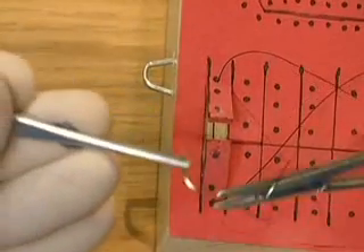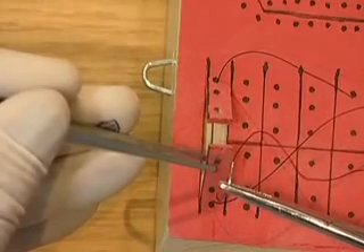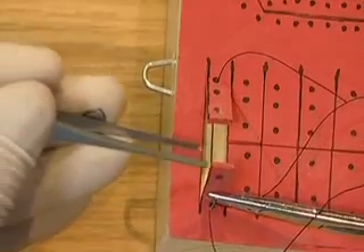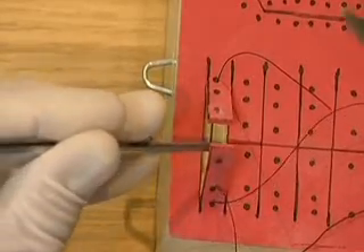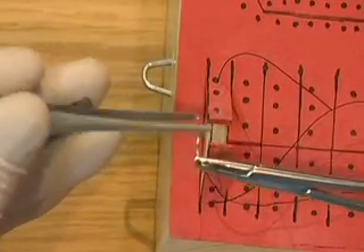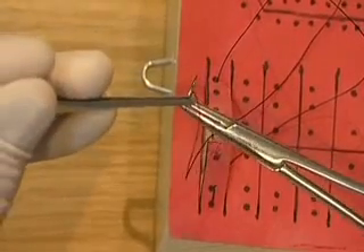Reverse the needle direction. Pick up the flap and insert the needle through the next hole. Pick up the needle with the tissue pickups and pass the needle to the needle holders. Pull the suture through. Correct the needle grip so that the needle is at right angles to the needle holders.